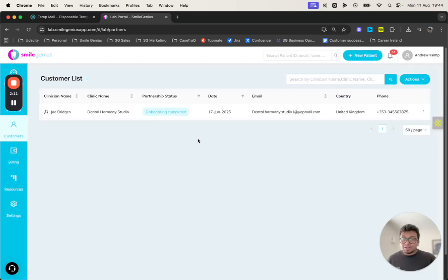That being said, through 3 different ways, we have made it quite simple for that migration process to happen, as well as to manage your existing and ongoing future growth.